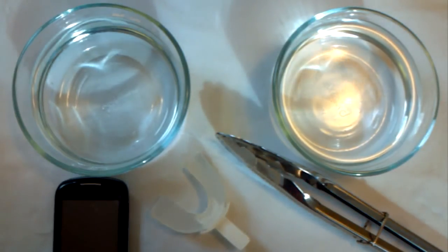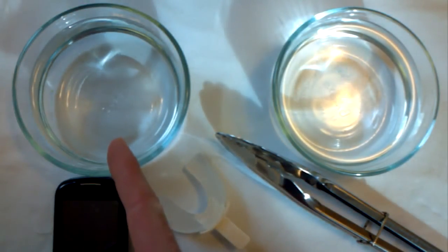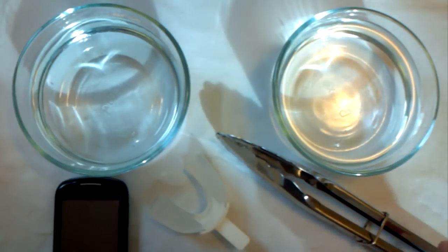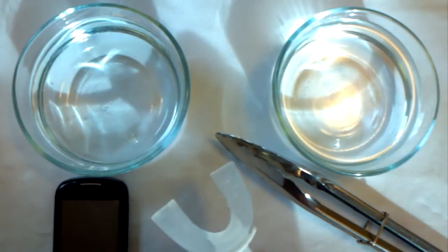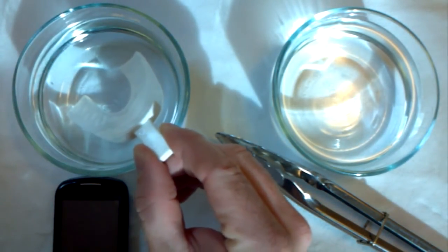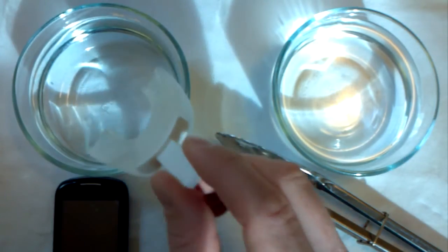What I have here is a cup of boiling hot water. I just took this off the stove about a minute ago. This is a cup of cold water, a pair of tongs that's used for retrieving the mouthpiece, the actual mouthpiece, and a timing device. Basically what you're going to do is take the mouthpiece and drop it into the hot water. This is going to remain here for exactly 3 minutes, no more, no less. At the end of 3 minutes, you're going to take it out.